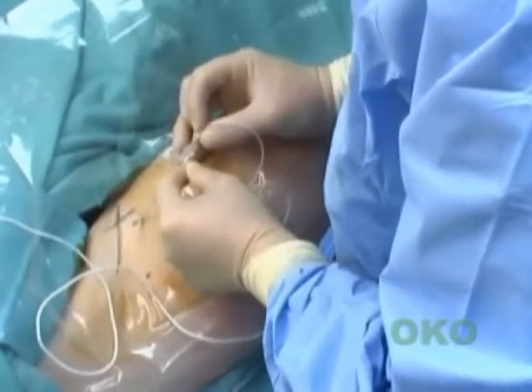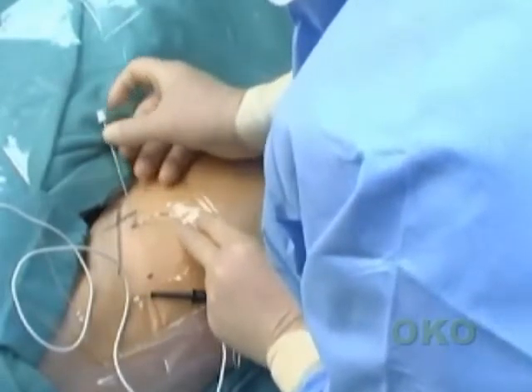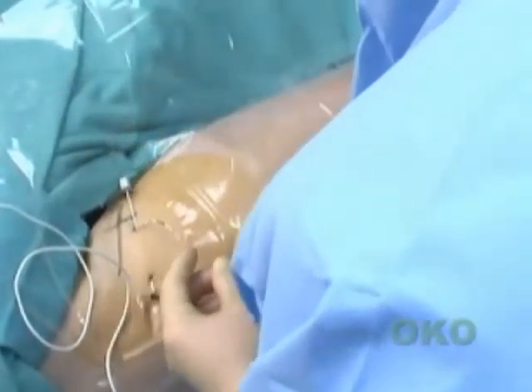Remove the needle without disturbing the catheter. The catheter is tunneled by first inserting the inner stylet of the needle 1 to 2 millimeters from the catheter exit site if a skin bridge is required, and advancing it subcutaneously to a point approximately 8 to 10 centimeters laterally if this is appropriate for the surgery. This area has previously been anesthetized.